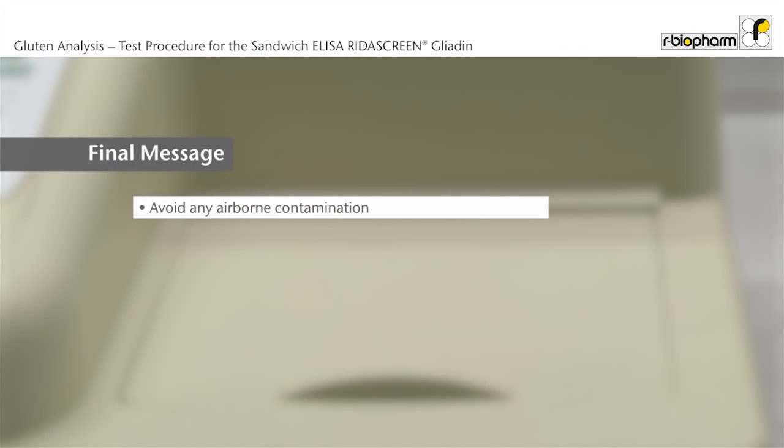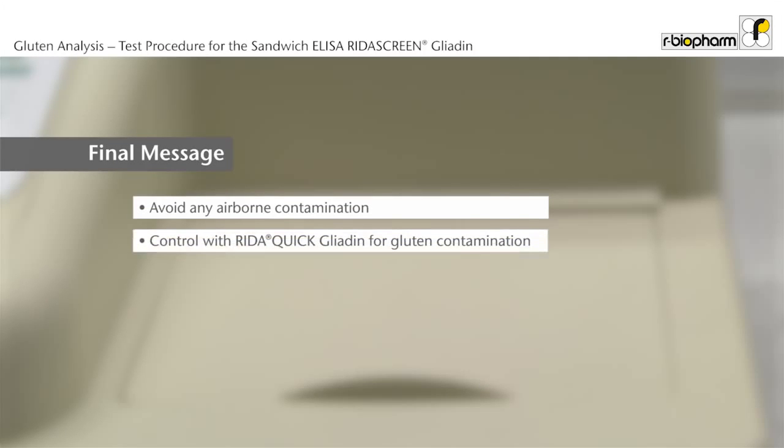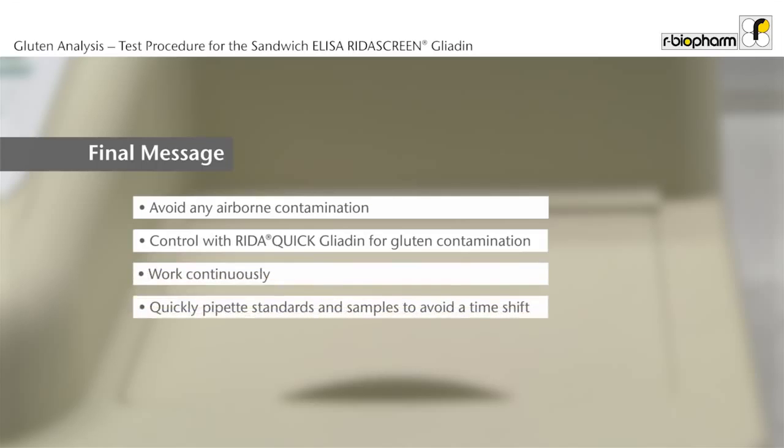Avoid any airborne contamination from cereals. Keep windows closed. Control with RIDA Quick for gluten contamination. Have a continuous workflow during the assay procedure. Please notice that the reaction starts with the addition of the first standard or sample to the plate. Therefore, standards and samples should be added quickly to the plate to avoid a time shift.